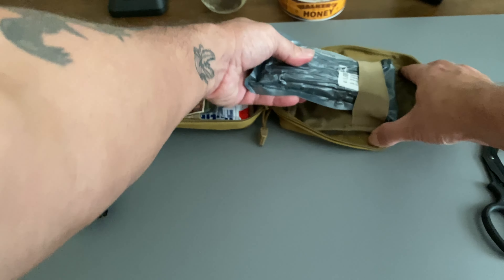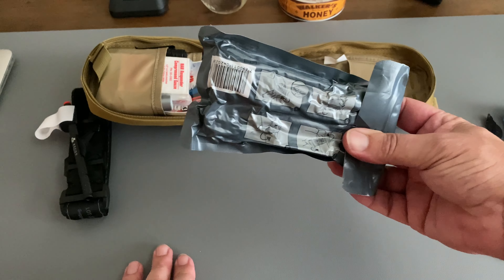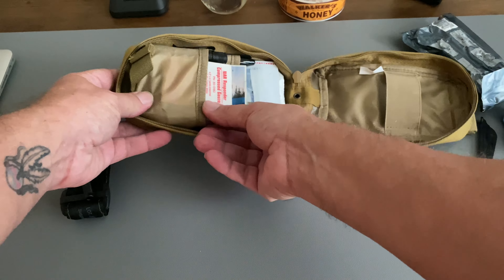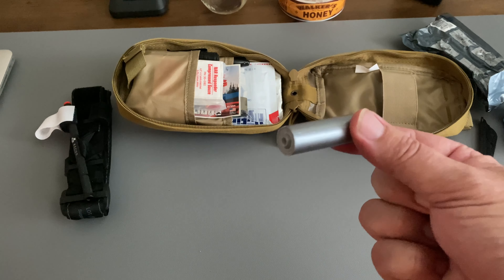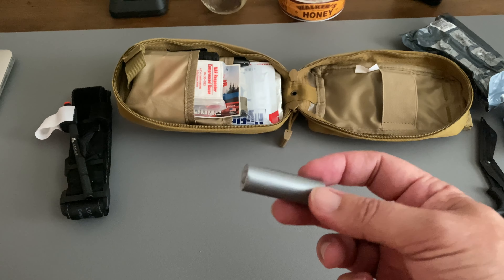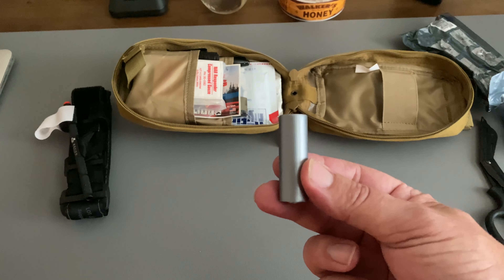Up in here we have our Israeli bandage, ready to go. On this side, a small roll of duct tape. Why duct tape? Why not duct tape? Duct tape does everything — we threw it in. You never know when a little roll of duct tape may come in handy.